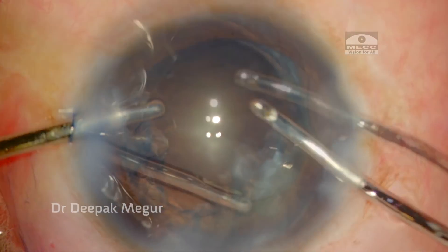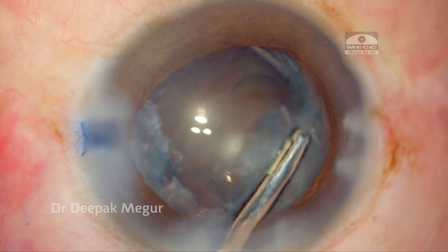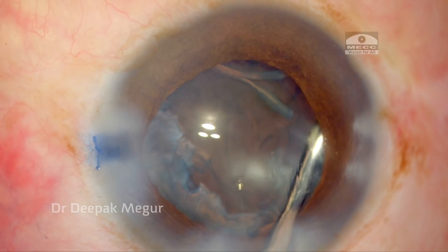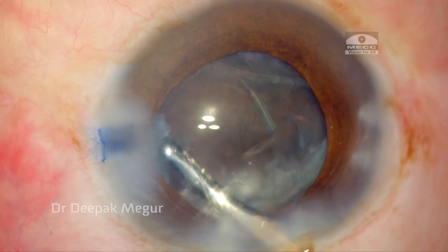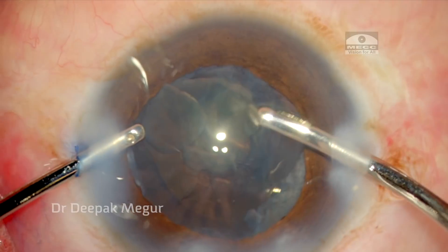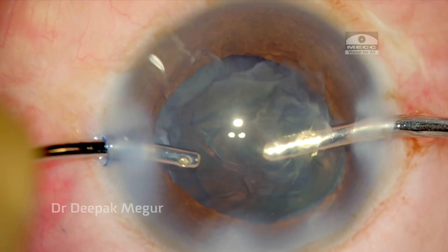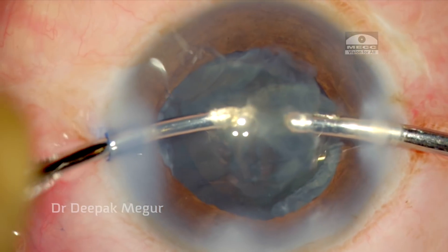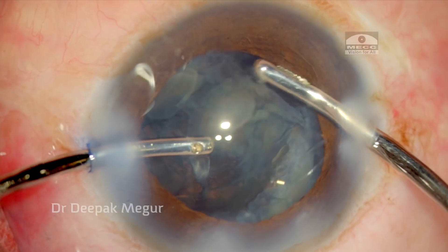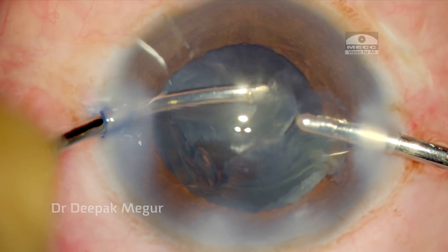The next plan is to use fluid to dislodge the epinucleus out of the bag. I go in with my irrigating cannula, trying to get under the epinucleus, and luckily in the inferior quadrant I find a cleavage plane where I can introduce my cannula underneath the epinucleus. The fluid pushes the epinucleus up out of the bag, and it is gently maneuvered out. Once part of the epinucleus is out of the capsular fornices, it can be very easily aspirated.